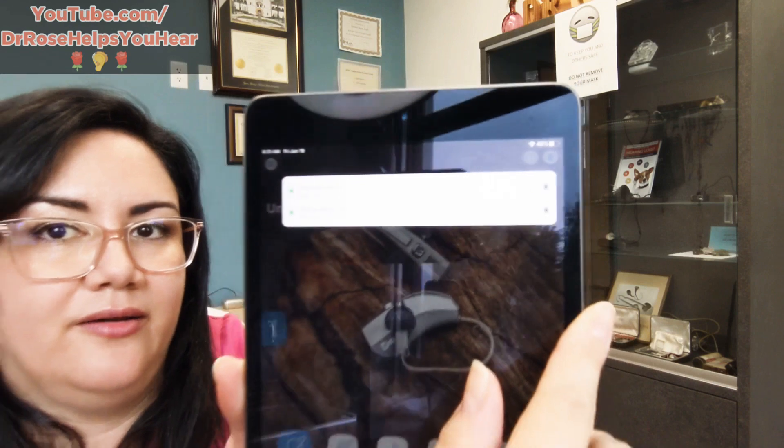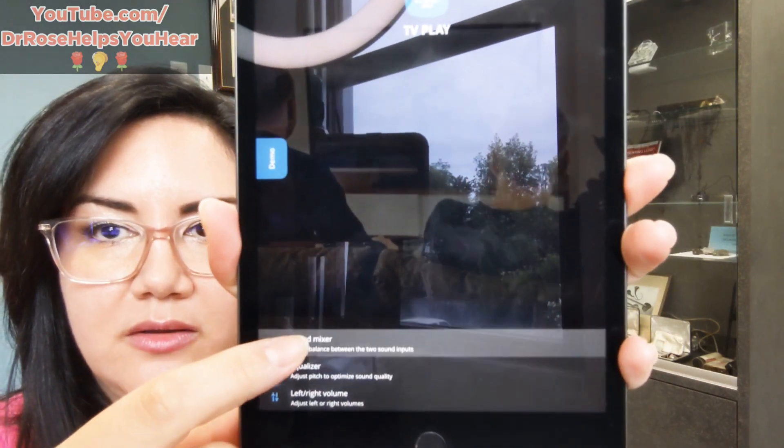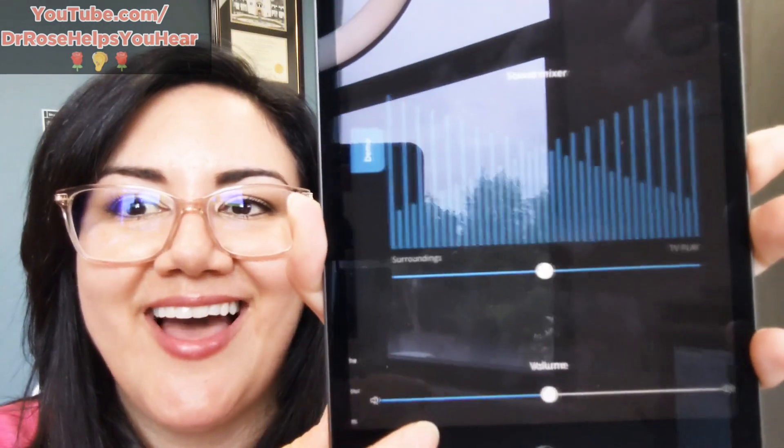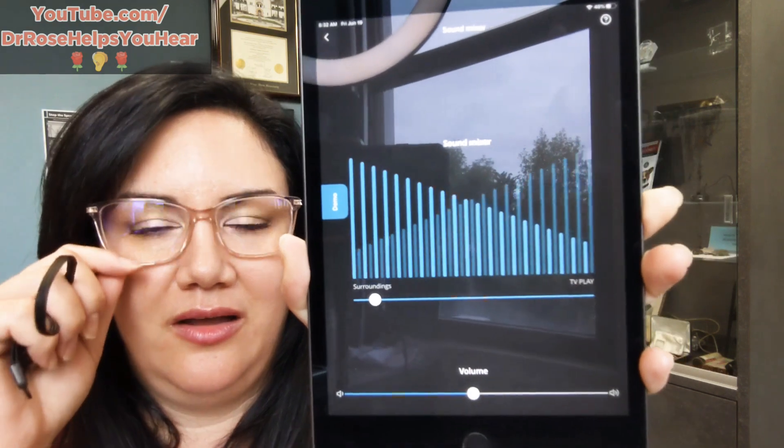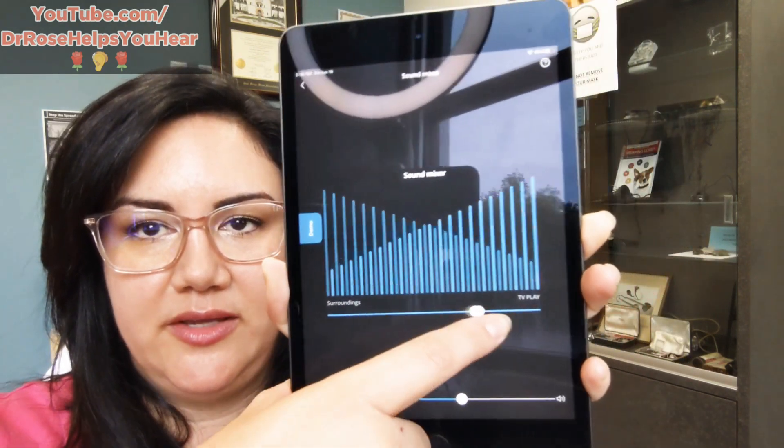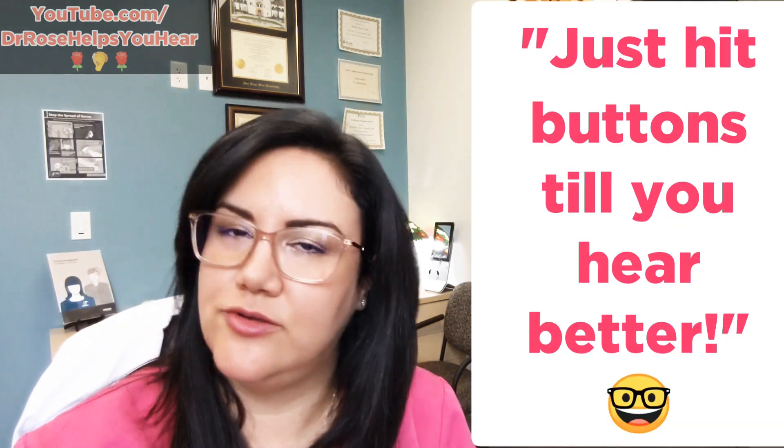In the top right corner there's a little battery symbol to let you know you're connected and what your batteries are doing. For the TV program, under sound menu there's a sound mixer where you can adjust the ratio between TV and your hearing aids — more TV or more surroundings — and you can control the volume there too. It's a bit of a learning curve for some patients, but just hit buttons until you hear better.